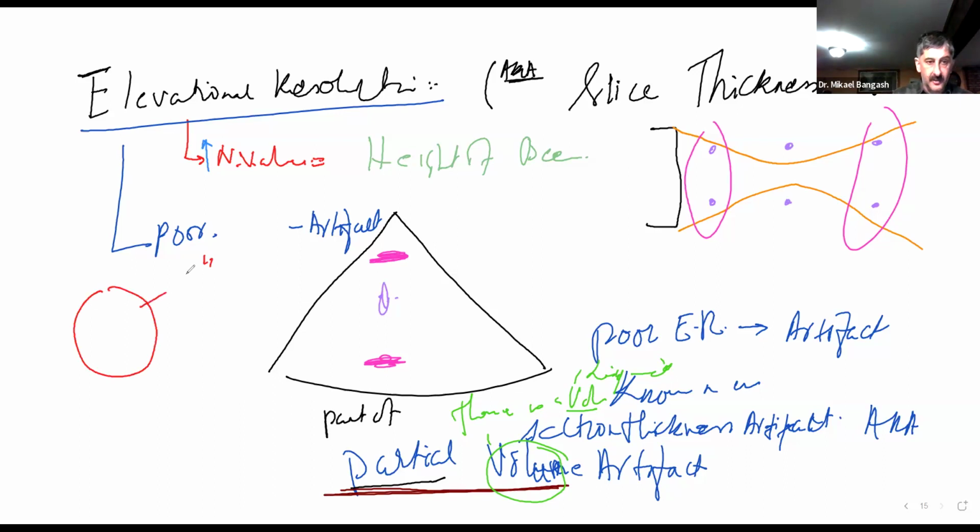A cystic structure may appear as if it is partially filled with liquid, which is wrong, which is fake.